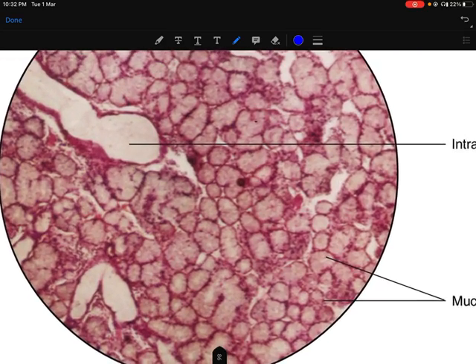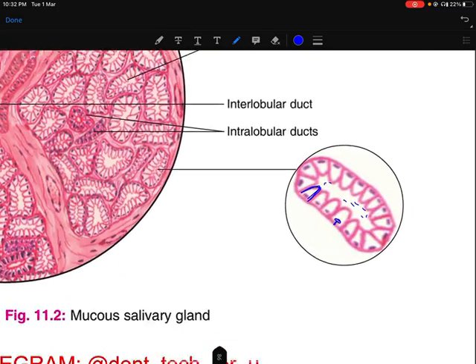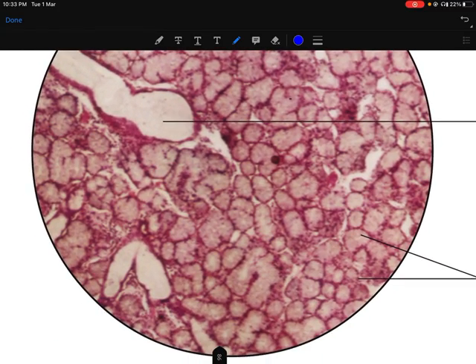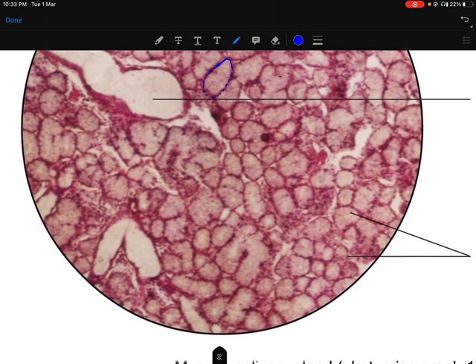And if you get this picture, you'll see that. And what they were saying, the apical portion is very empty. So that is there. If you get this picture, you'll see mostly like the black. It's very stained at the basal area. Also, it's ovoid, it's tubular in shape.